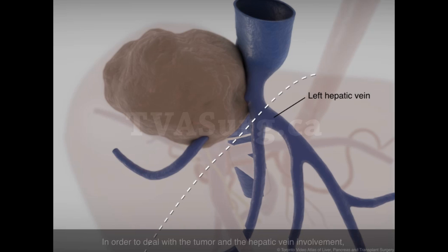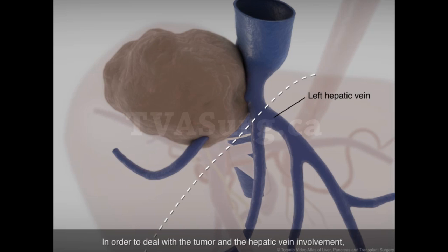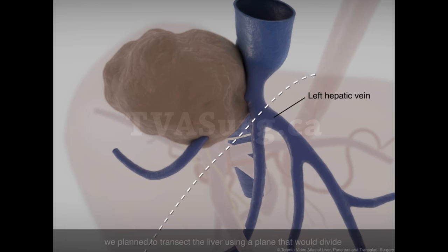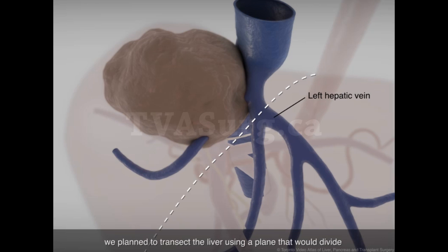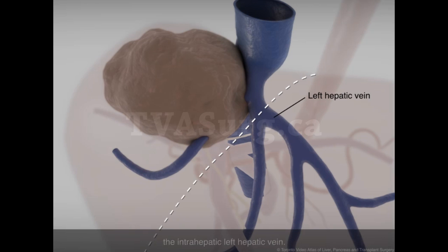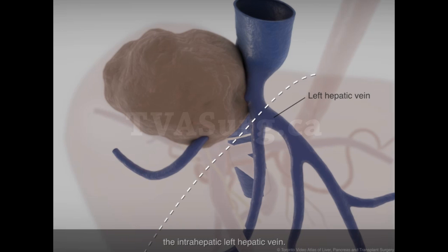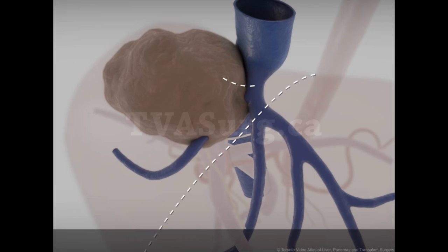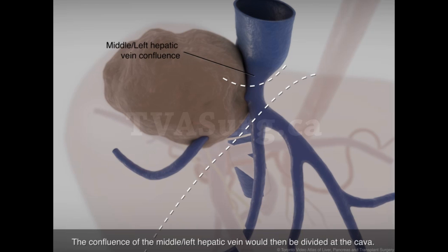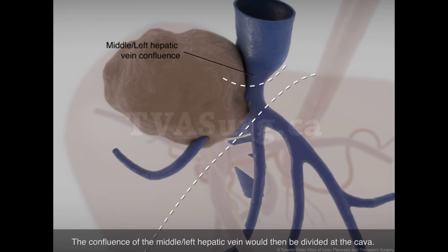In order to deal with the tumor and the hepatic vein involvement, we plan to transect the liver using a plane that would divide the intrahepatic left hepatic vein. The confluence of the middle left hepatic vein would then be divided at the cava.